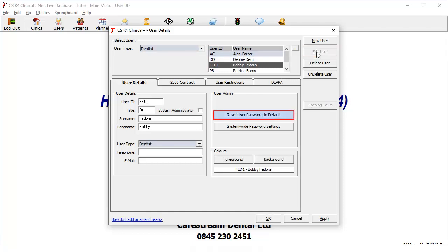Click Reset User Password to Default. The password will then be reset to the default system password set by the administrator.